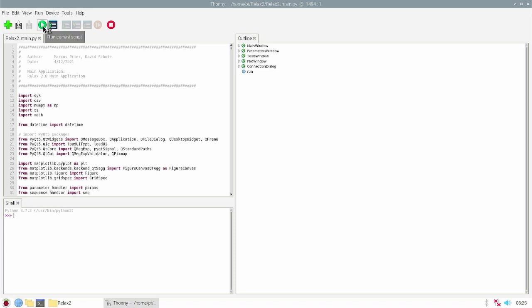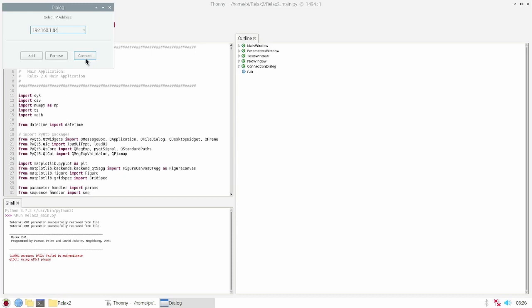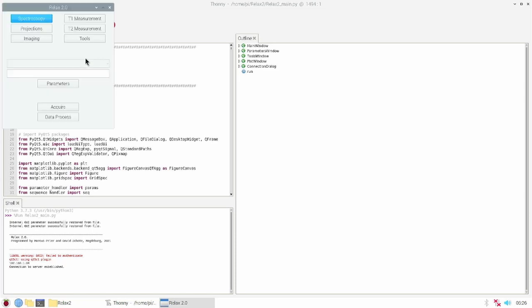Here I execute the script to start the graphical user interface. This popup dialog needs the IP address from the Raspberry Pi. When I have the right IP address I can connect and the main window will open.